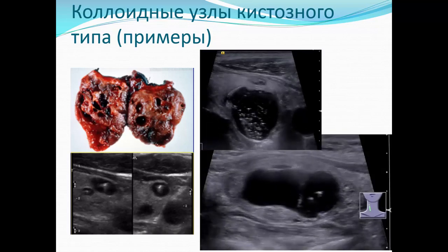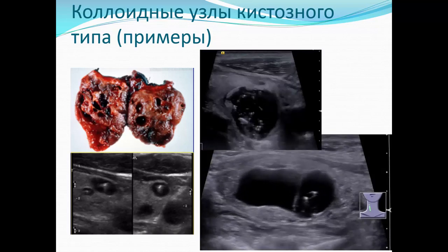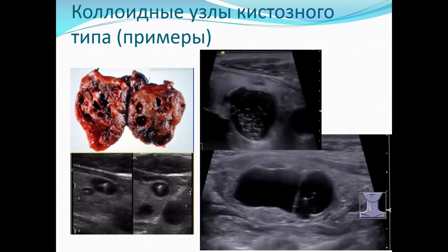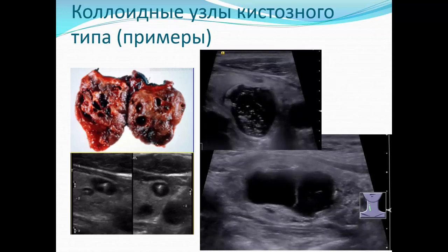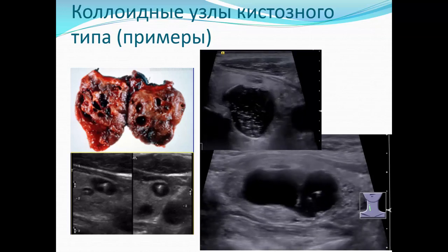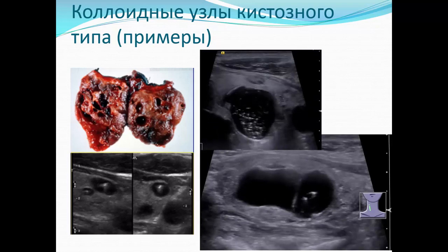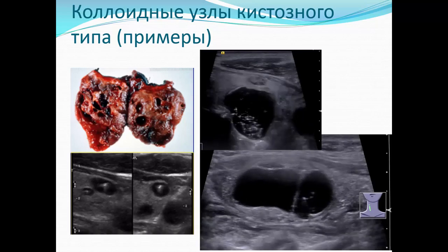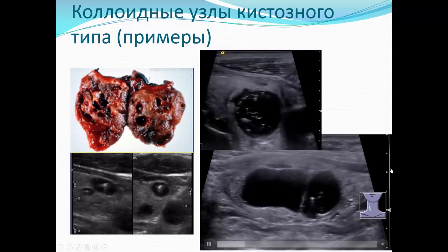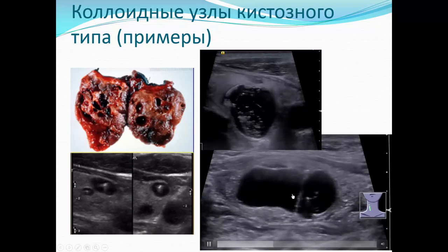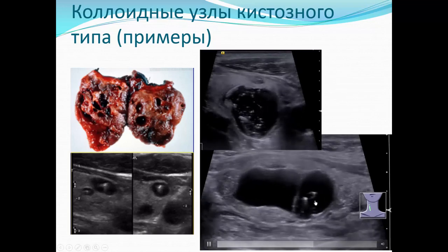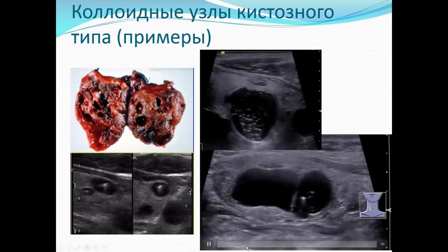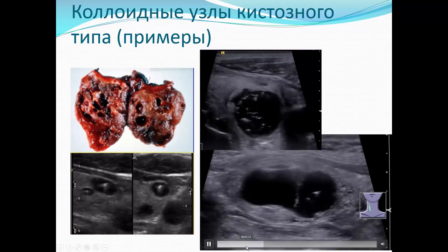Ещё один пример: узел, который трудно дифференцировать на единичной кинопетле, — результат слияния двух прилежащих кистозных полостей или кистозная полость, разделённая перегородкой. В одной части явные признаки феномена хвостов кометы, в другой — нет. Так или иначе, всё это относится к одному и тому же пятому морфотипу — ситуация спокойная.